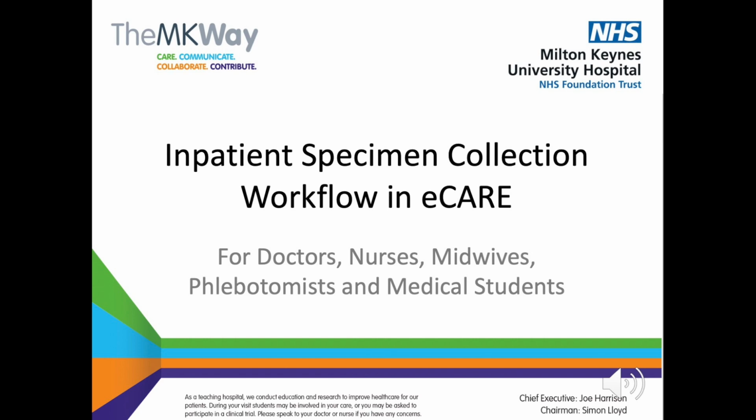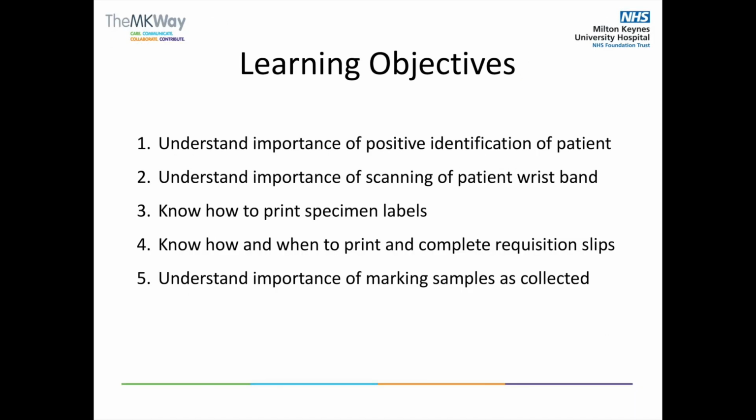This video is aimed at doctors, nurses, midwives, phlebotomists and medical students that need to take specimens from inpatients. Having watched the video, you will understand the importance of positive identification of patients. You will understand the importance of scanning the patient's wristbands.